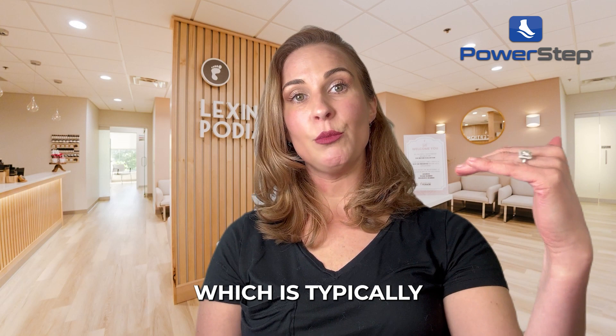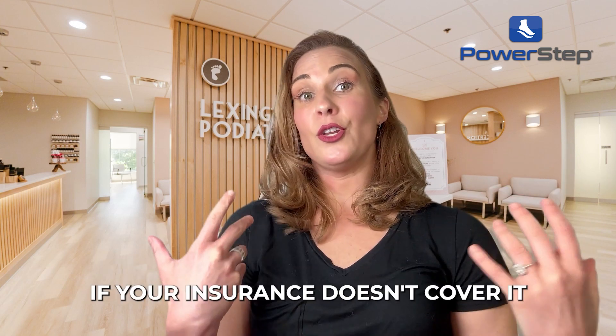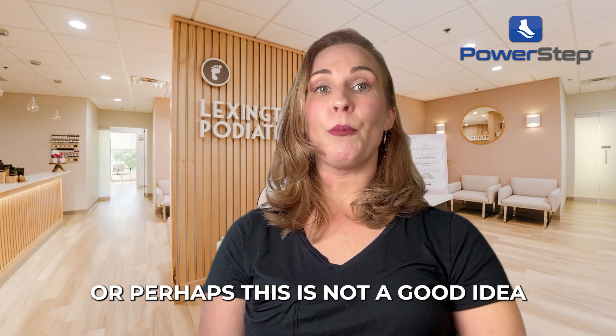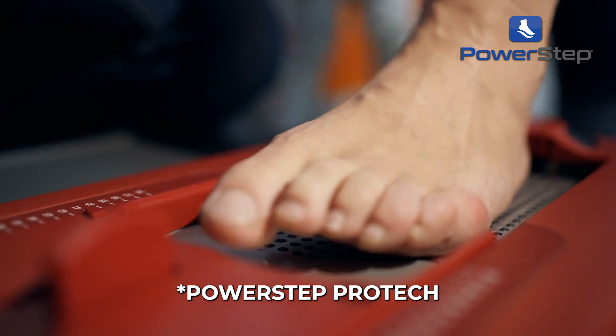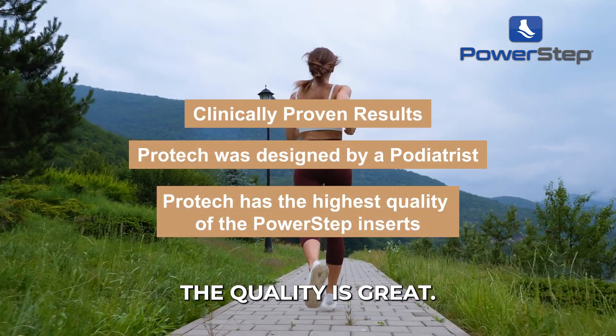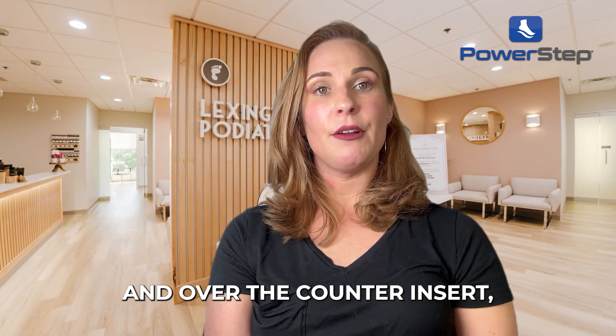Then you can go into: my first recommendation, which is typically a custom orthotic and why. My second option is: hey, if your insurance doesn't cover it, or perhaps it's just not a good time for you to get a custom, I love PowerStep. They fit great, the quality is great, and it lasts a very long time.